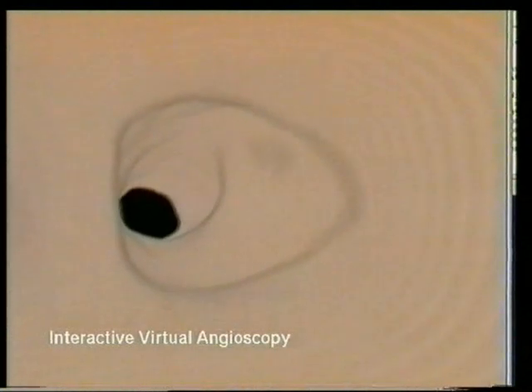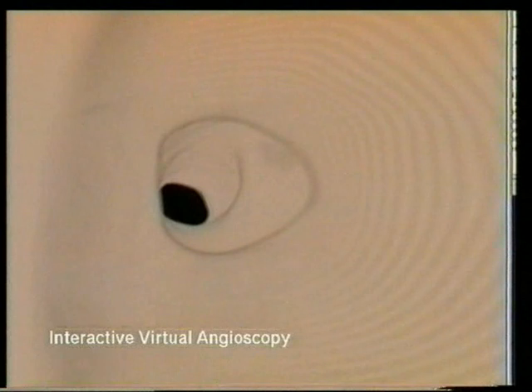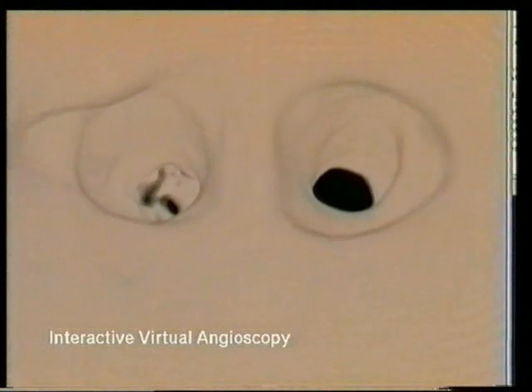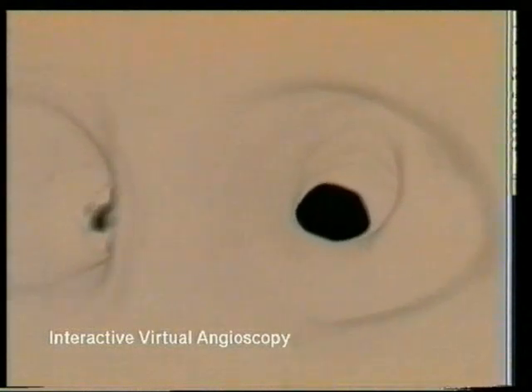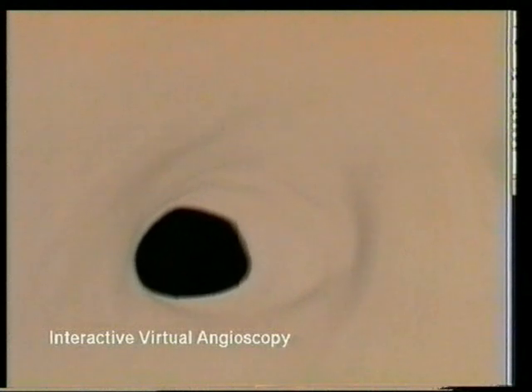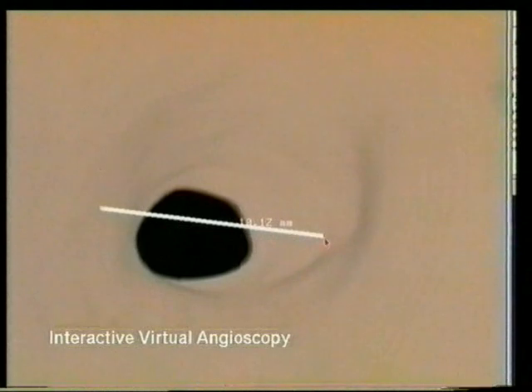The endoscopic view is generated from a 256 x 256 x 32 CT dataset at 12-bit resolution. We see a stenosis area 2 cm beyond the carotid bifurcation and interactively inspect and measure lumen variations. The sequence emphasizes that virtual angioscopy provides good 3D localization of arterial lesions and precise reconstruction of their geometry.